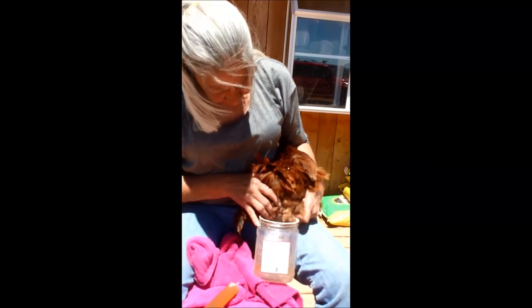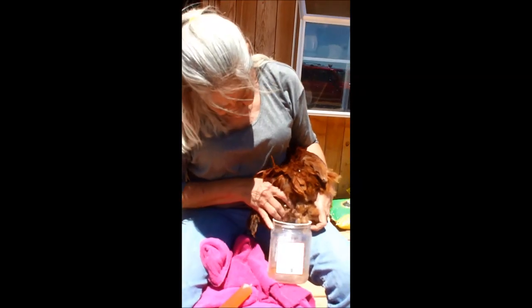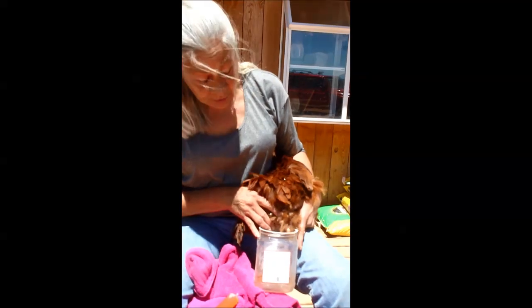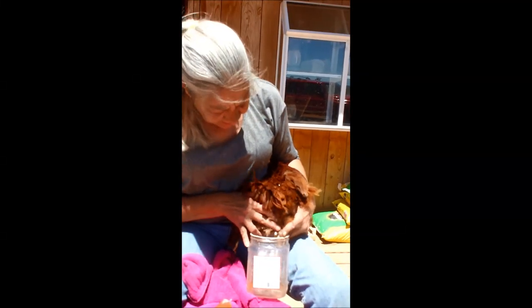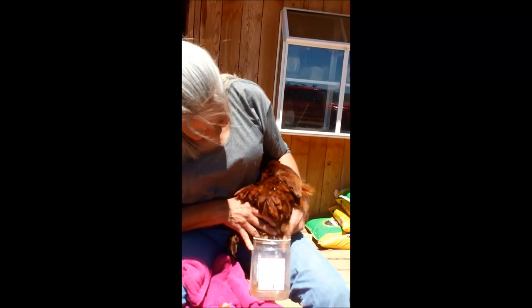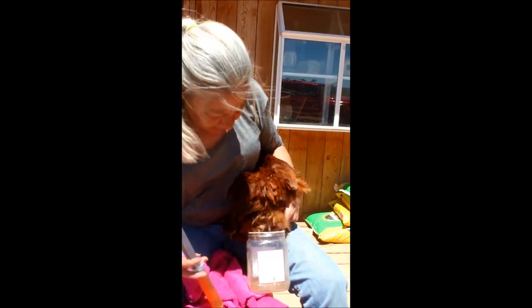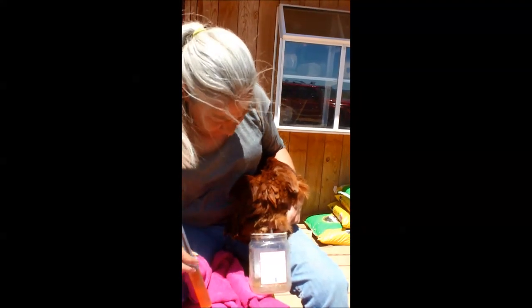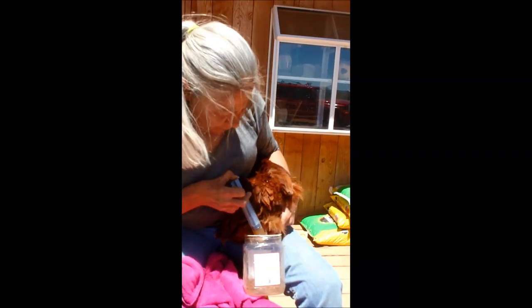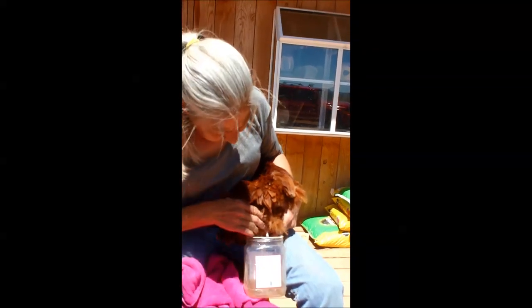This may take a while. You can gently apply pressure to the abdomen where the swelling is. I would recommend you use gloves. Since I didn't, I'll be washing my hands really good. I think I may connect the syringe again and draw it out again.